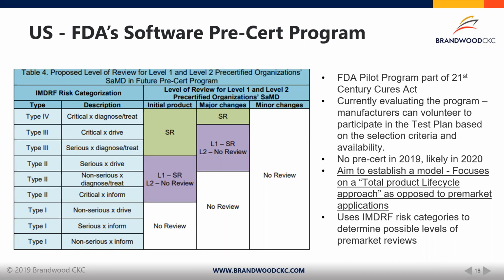The aim of this program is basically to provide a framework for the classification of software under the risk categorization that's been established by the IMDRF, which, based on the type of functionalities of the software and the type of disease that the software is affecting, provides a type of review to be undertaken in the pre-market phase. So the whole idea of this program is basically to rely on a total product lifecycle approach as opposed to simply going through a pre-market phase application to present what's the risk model for the software. So watch this space.